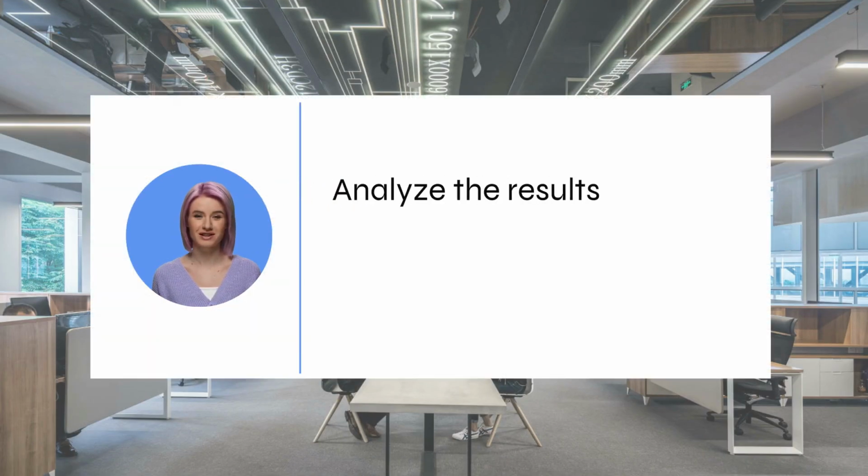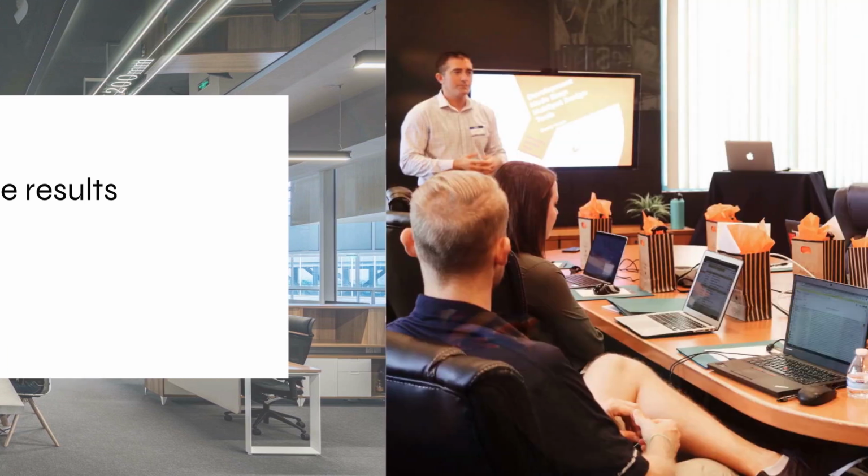The final step is to analyze the results of the clinical studies. Comparing the clinical performance of the software to the intended use, clinical benefits, and risks outlined in the clinical evaluation plan is essential. After conducting the comparison, the analysis results are then utilized to determine if the software is safe and effective for use in clinical settings. The analysis results are also used to assess whether the software meets the regulatory requirements for marketing and sale.